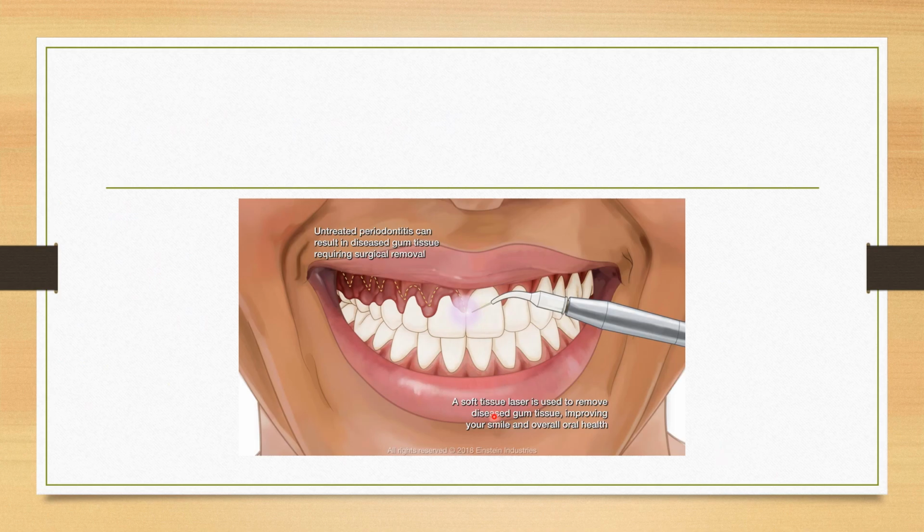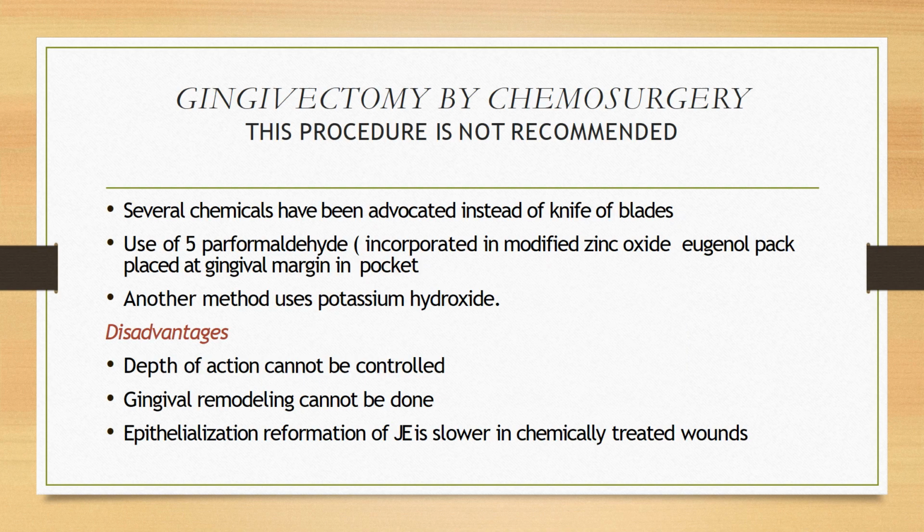So this is just the diagrammatic representation. We are doing cases in the department on a daily basis, so you can come and assist individually, to see the cases and understand how it is done. You can see what postoperative instructions are given, what the result is, and the satisfaction level of the patient after laser gingivectomy.